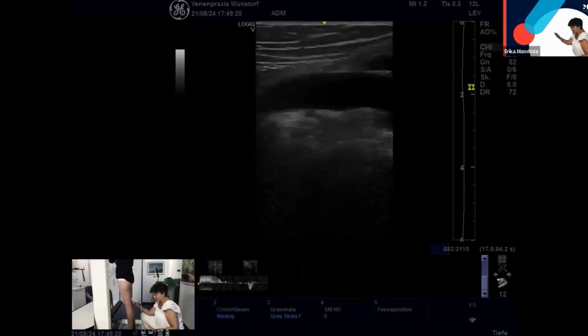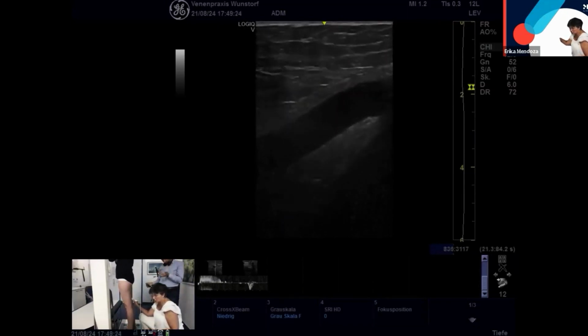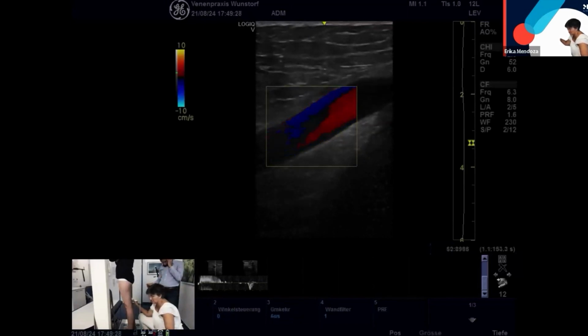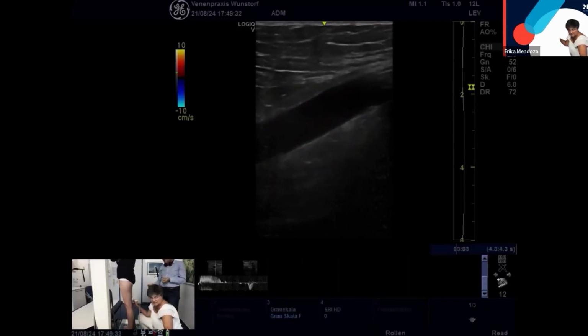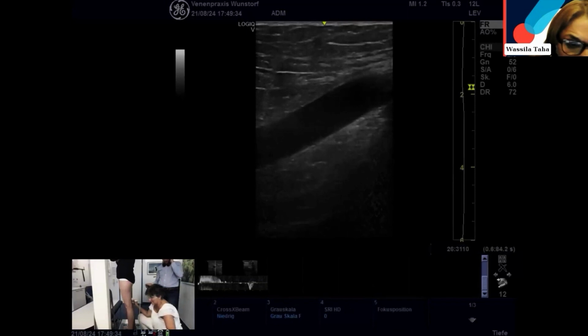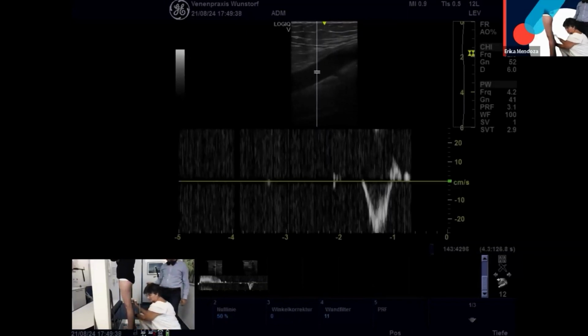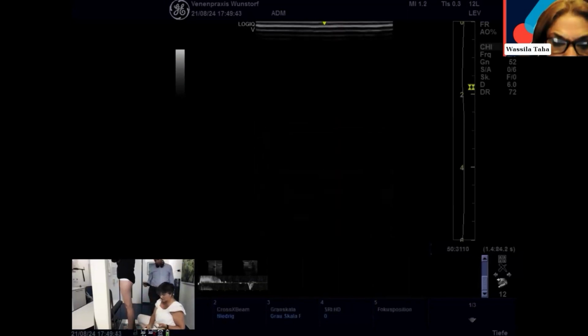This is the classical perforating vein reflux due to superficial venous incompetence. The deep vein is perfect. The contours are perfect. You are on the popliteal vein now. It is a perfect venous system. It's competent. It's a healthy vein.